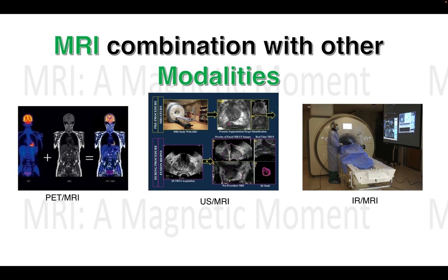Interventional MRI can be used for a variety of specialized procedures. These systems are often used for doing biopsies of lesions, resections of tumors, guiding thermal ablation of tissues, as well as other procedures. It is commonly used in neurosurgery, though, where every millimeter of tissue spared in surgery can make a difference for patient recovery. So we can note that MR technology combined with other modalities is a great tool in diagnostic imaging.